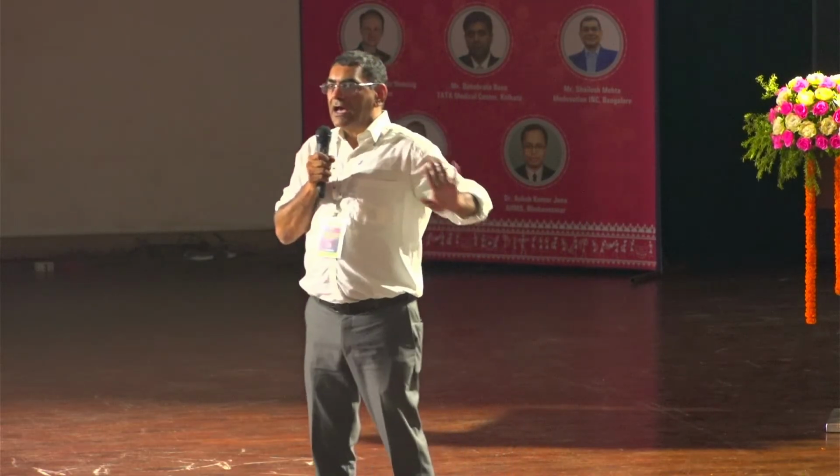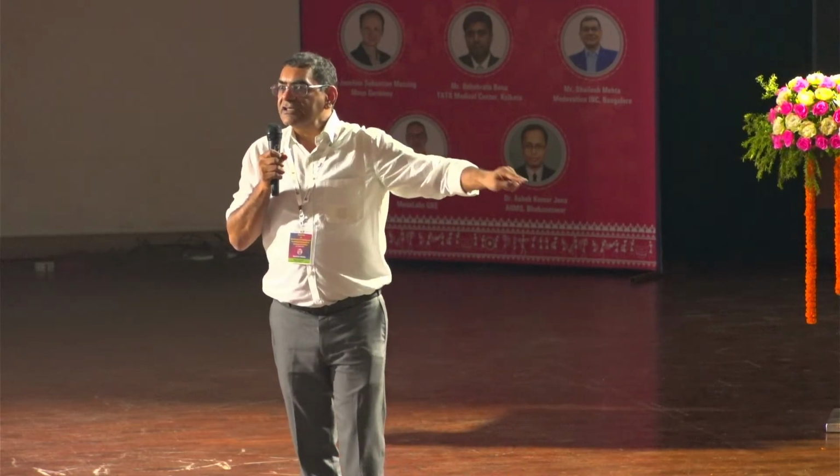अपने CSSD भाई लोग SUD करते क्या नहीं करते हैं? अपना काम क्या है? स्टरलाइजेशन होता है कि नहीं होता है? ओके. आप लोग को बड़ा छेद में इंफेक्शन ज्यादा होता है या छोटे छेद कार्डियक कैथेटर में जल्दी इंफेक्शन होता है या वेंटिलेटर सर्क्यूट्स में? Which is more difficult to sterilize? वेंटिलेटर सर्क्यूट्स या कार्डियक कैथेटर्स?